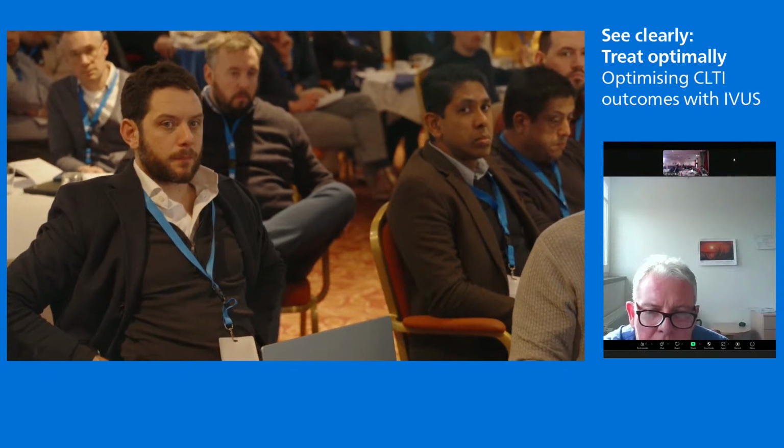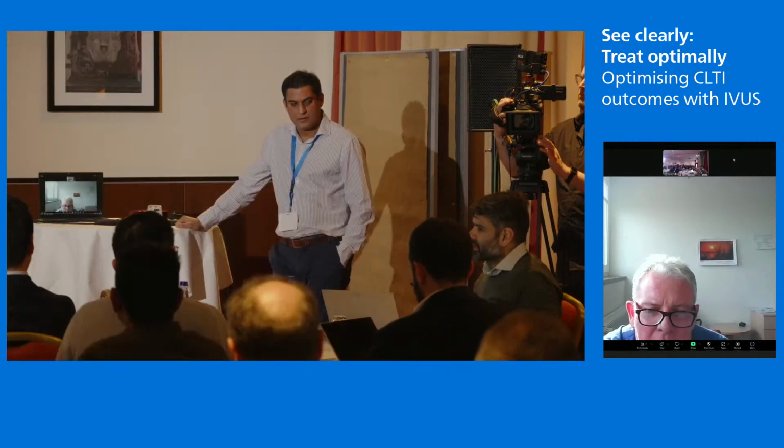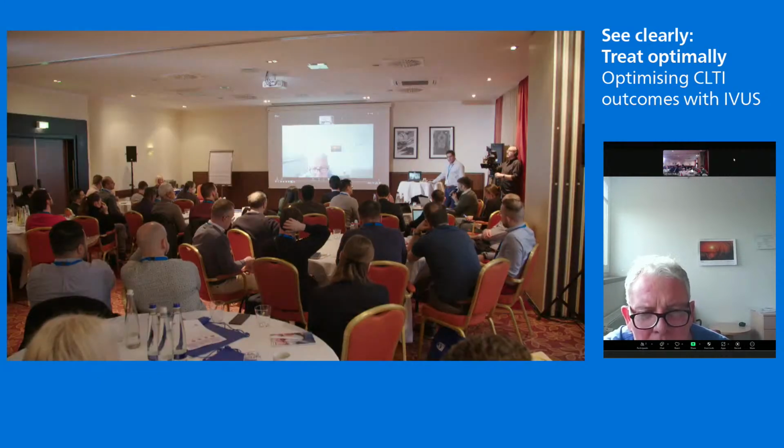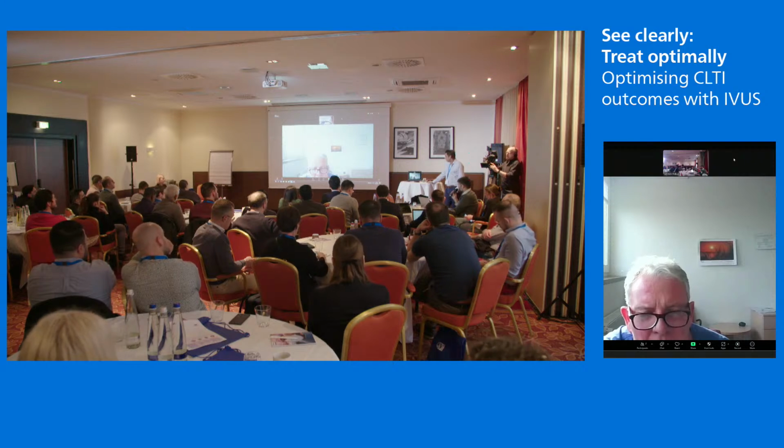Another question here. It's Narayan from London. Just to take things back to IVUS for a second, because I think this case showed it really well, that there was a technical problem at the distal end of the stent that was probably the reason why the stent went down in the first place.